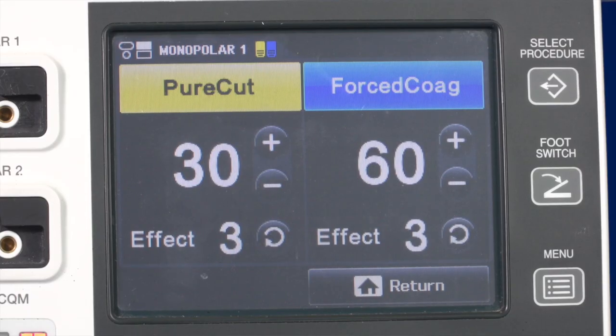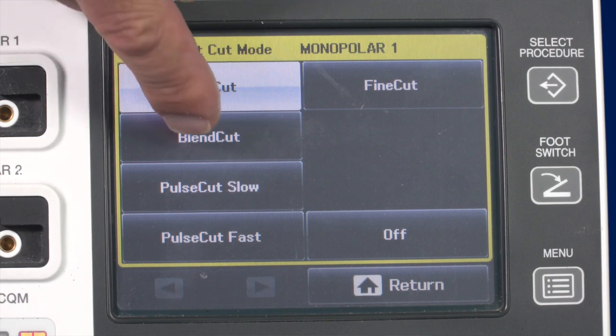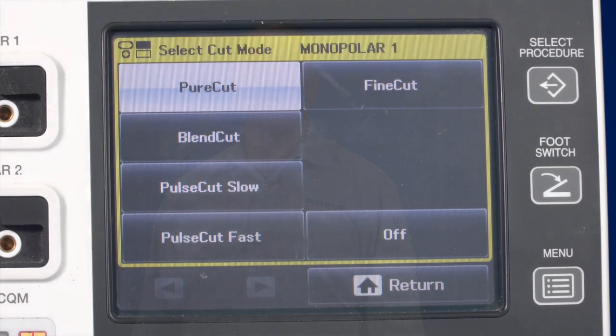For standard surgical applications, there are three important cut modes: pure cut, blend cut, and fine cut. The pure cut mode allows you to cut tissue as if you were using a scalpel, with little to no hemostasis. If you desire a cut mode with a greater hemostatic effect, use the blend cut mode. The fine cut mode is used with thin instruments, such as a needle electrode.